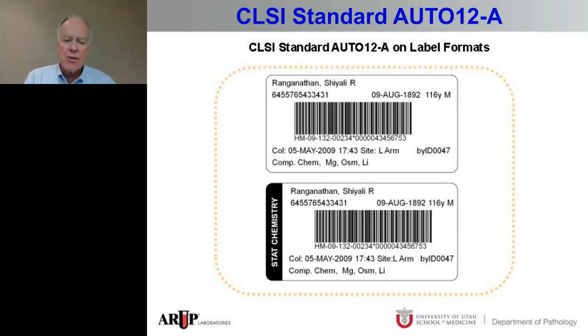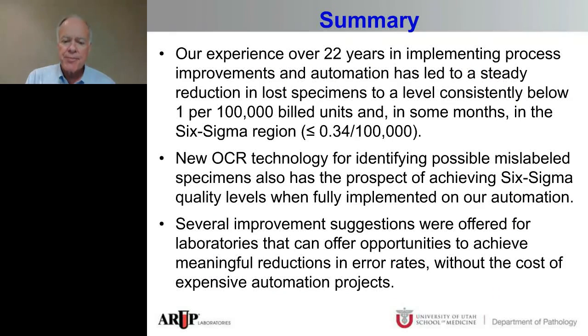And there's a version of this label that has a priority code down the left side of the label. So this priority code would be easily visible if the tubes were in a rack or whatever, because the standard requires that these labels be placed so they're readable as they are now if the top of the tube, the cap or the stopper, is to the left of the label.